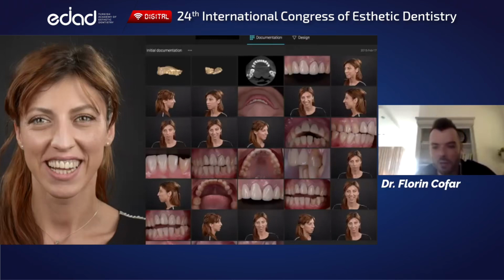You're going to do a design in the beginning, and then after ortho you're going to do another one, and then another one after the graft, and so on and so forth. But what are the chances that your initial design will actually look like your final design if you are always using the design as a reactive tool, adapting design to the situation? If you want to be predictable, I think you should consider doing it the other way around. At every stage, relate the clinical situation to the design and try to use the design as a scaffold or as a blueprint to understand where to correct.